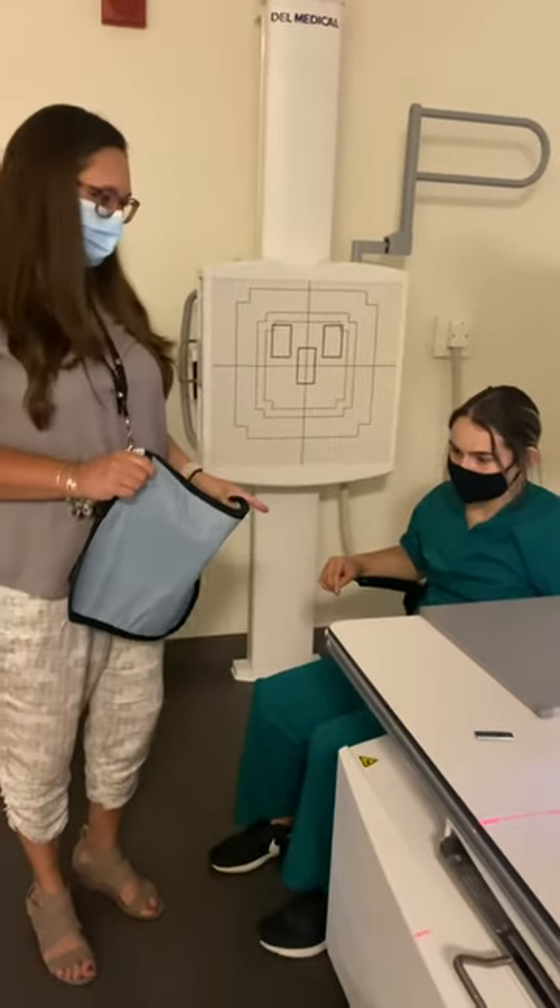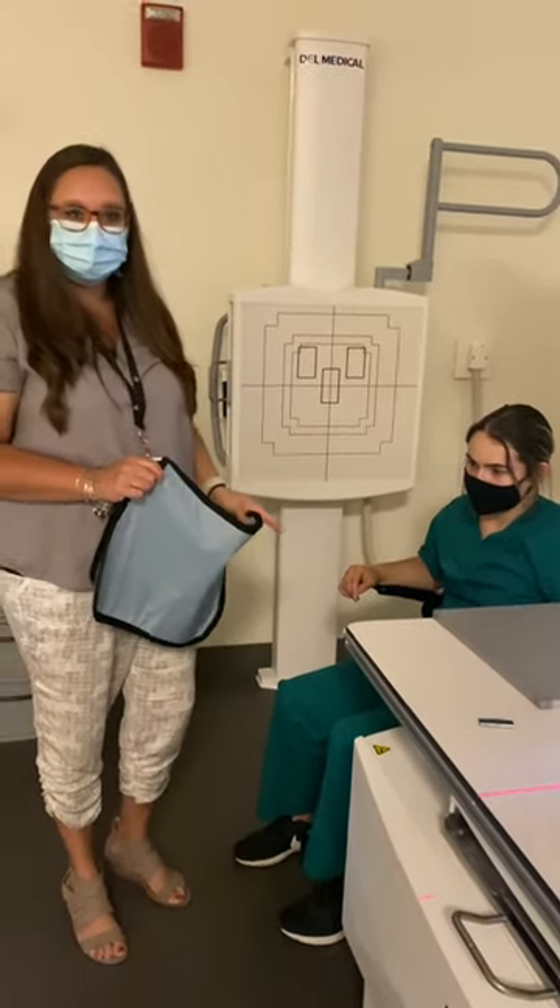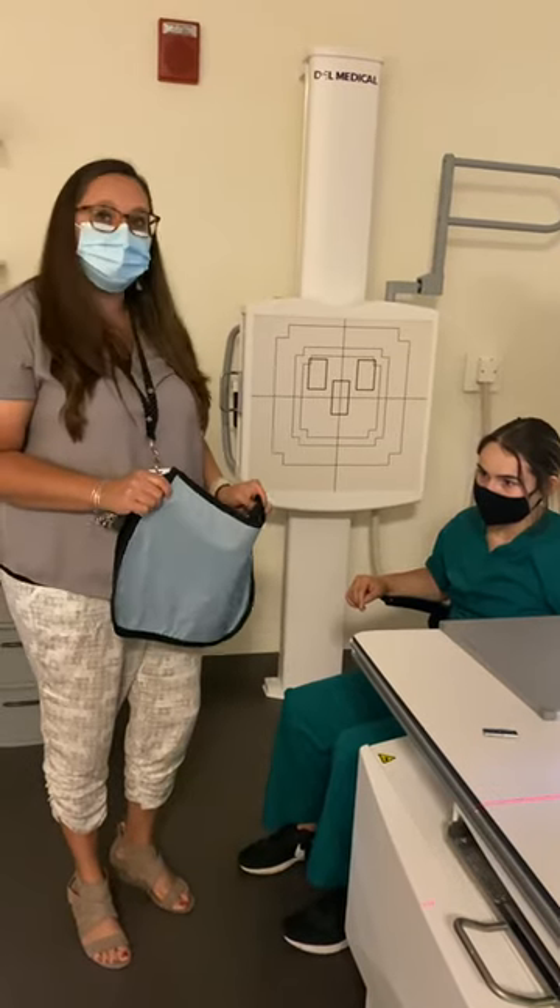For the elbow, we're going to do four views: AP, external rotation, internal rotation, and the lateral view.